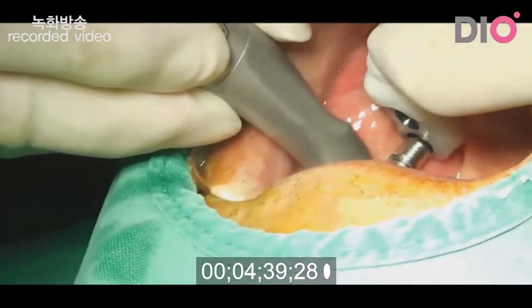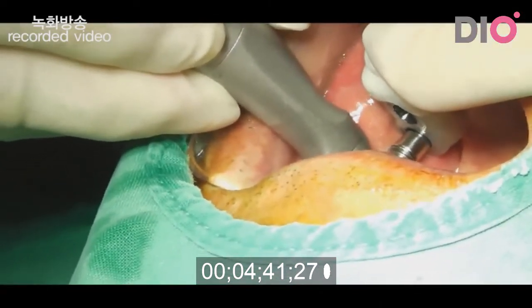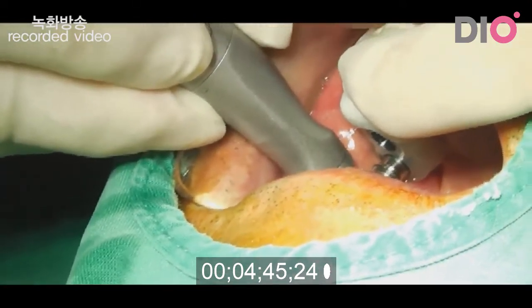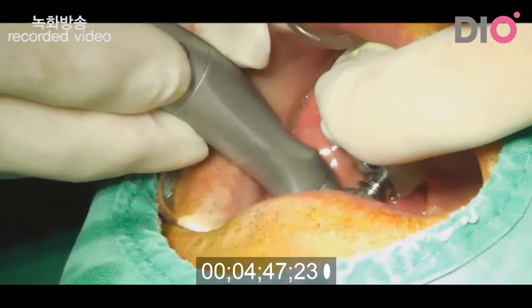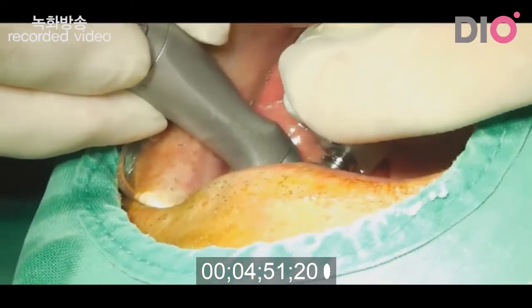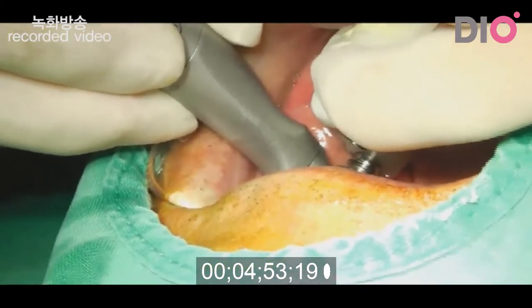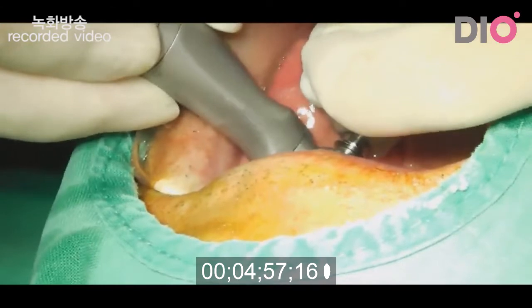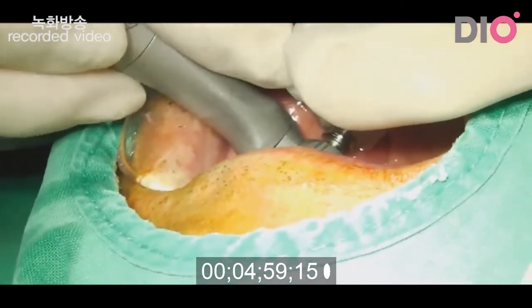This is 2.7 drill. Okay. I drill without irrigation.